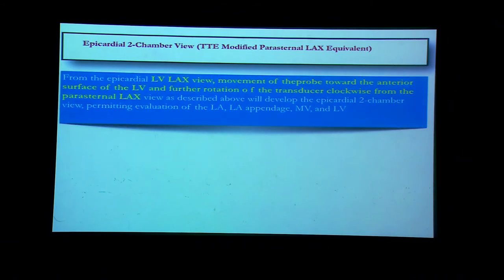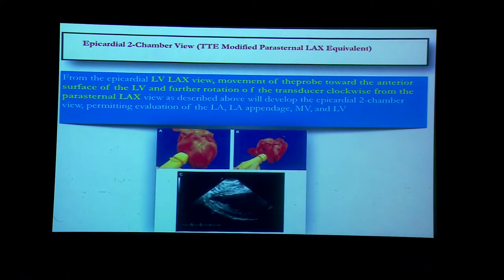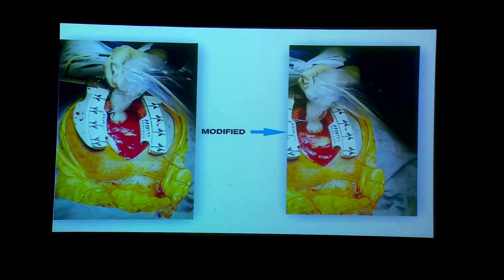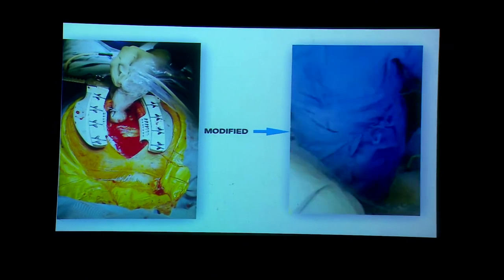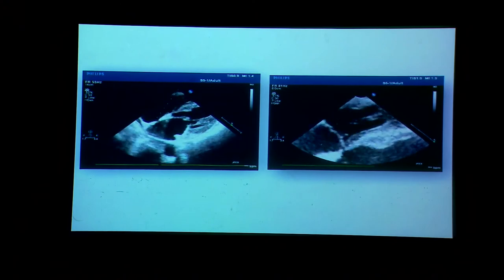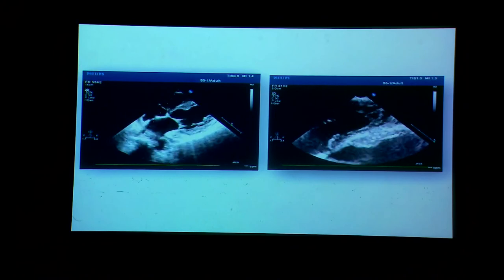From the same position, instead of going further towards the left ventricle, we go more towards the right ventricle and perform clockwise rotation to obtain an excellent four-chamber view. In this view we can see the mitral valve, tricuspid valve, and by zooming we can see the perimembranous septum, interventricular septal ruptures, and everything very well.